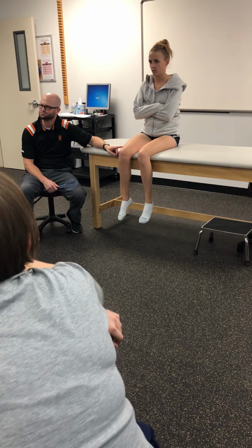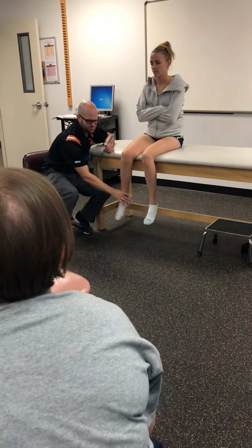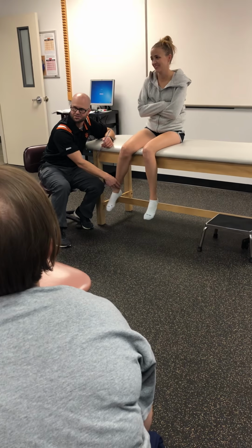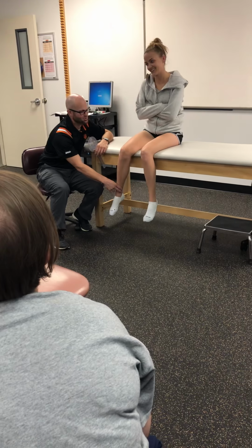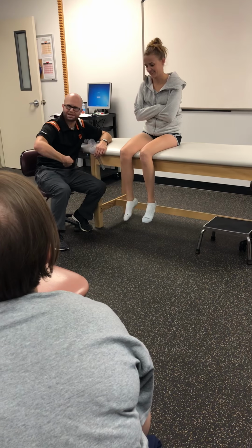Her foot will go that way. Out. Her foot will go out. She's got this option or she's got this option. Does everybody agree on this for internal rotation? You're turning that in. That is terrible. It sure is. You danced. Okay, internal rotation, the foot is going out.